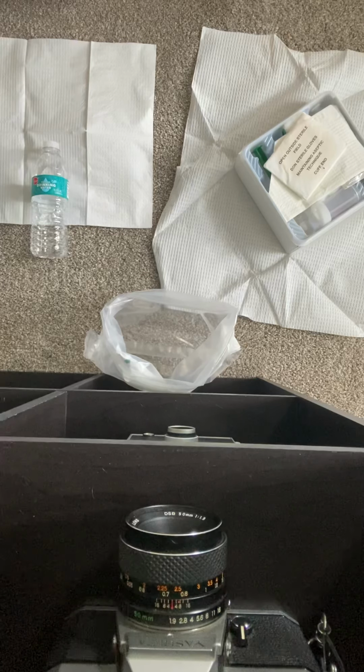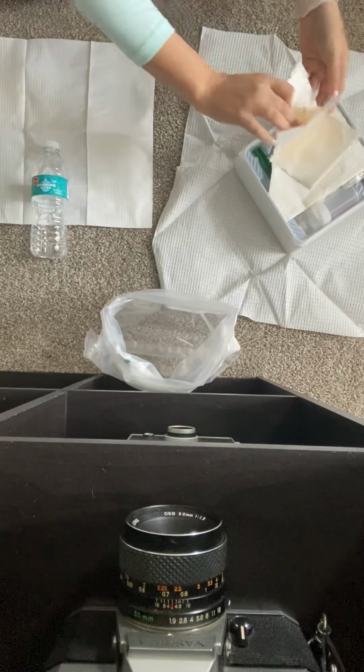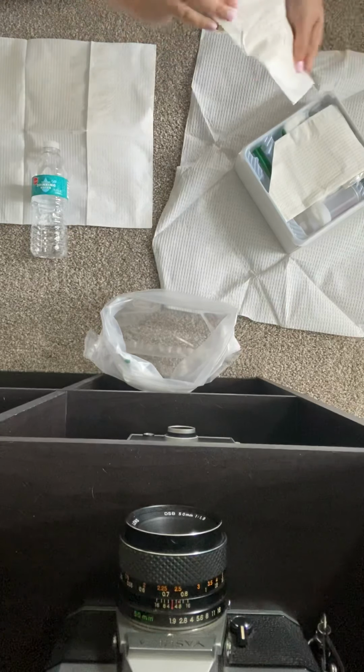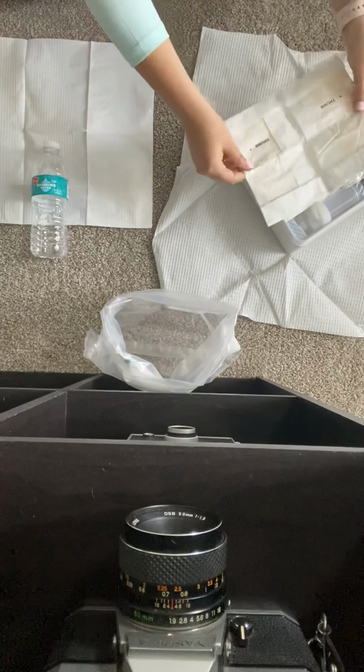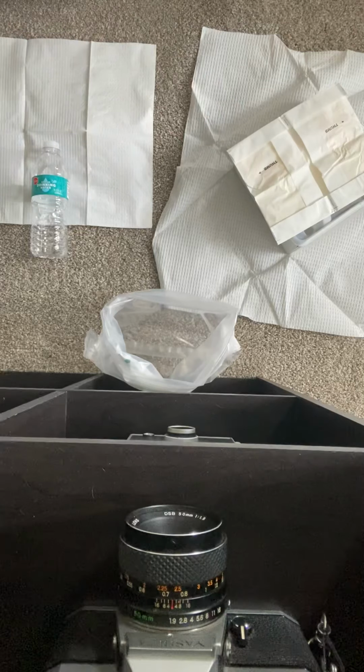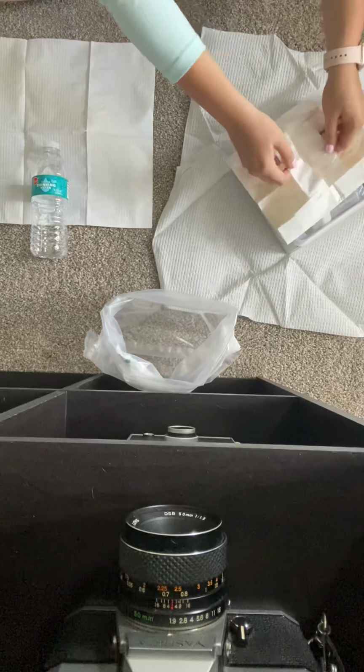Okay, so next thing I'm going to do is remove my gloves. Not really remove them, but take them out. So I'm going to set that there, and I'm going to go ahead and put those on.